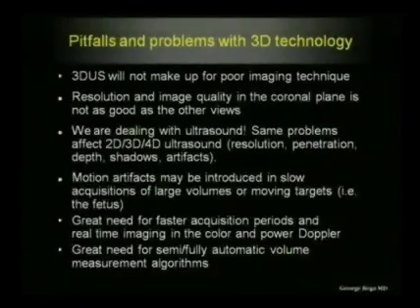Of course, there are pitfalls. As I mentioned before, artifacts are a problem, but the most important thing here is this. As we do it right now, 3D ultrasound is a 2D based technique. As such, it suffers from all the problems that 2D ultrasound has: penetration, resolution, frame rate, shadows, artifacts are all important factors that may impact 3D ultrasound. Of course, 3D ultrasound will not make up for a poor imaging technique.